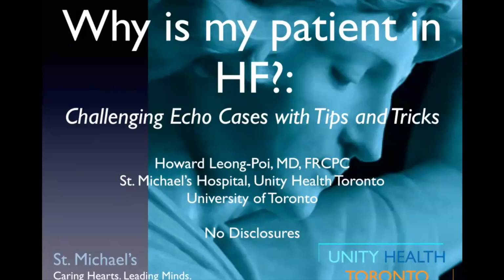It's one of the things that when I do an echo rounds talk, I want to be able to show lots of echocardiograms and make it interactive and make it practical. I think we get a lot of didactic aspects, which I think are important, but you want to be able to apply that to echocardiograms, and then as clinicians extend that to applying it to management of patients.